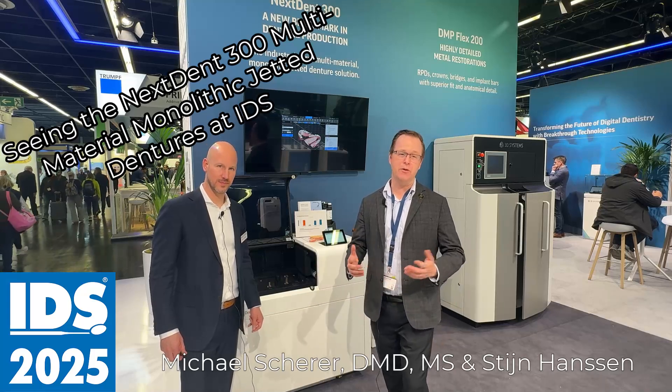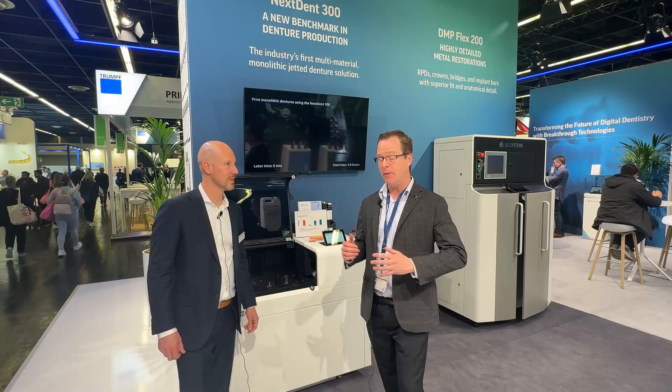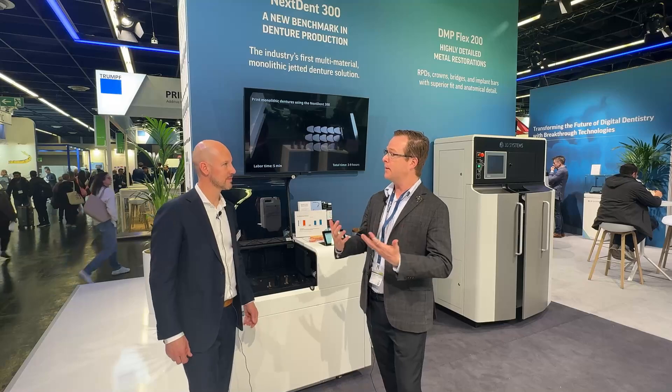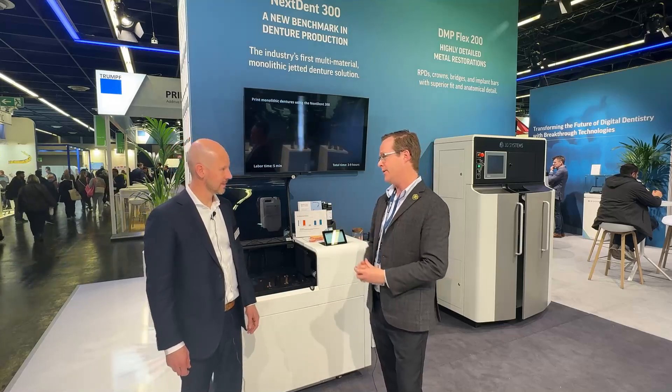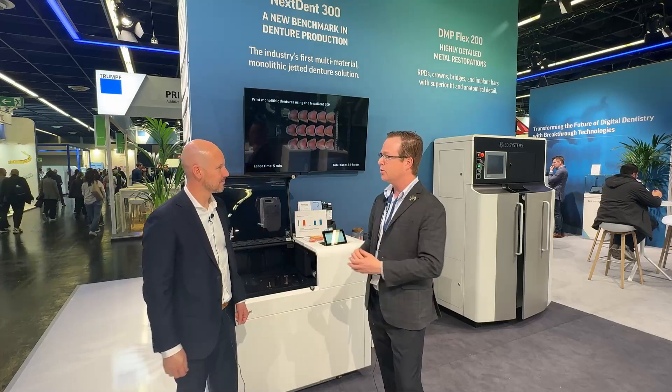Hey everybody, this is Dr. Michael Scherer coming to you from IDS here in Cologne, Germany, looking at some of the latest technology. Right now I'm here at the NextDent 3D Systems booth talking a little bit about 3D printing with Stijn. So Stijn, real pleasure — thank you so much for inviting me here to talk a little bit about your latest solution. Tell us a little bit about it.